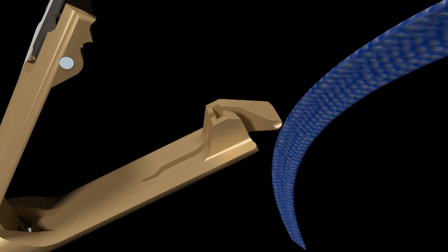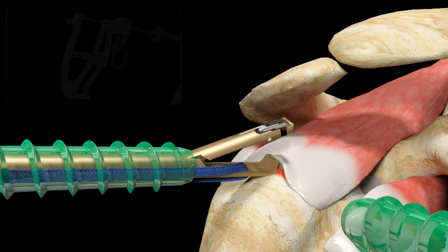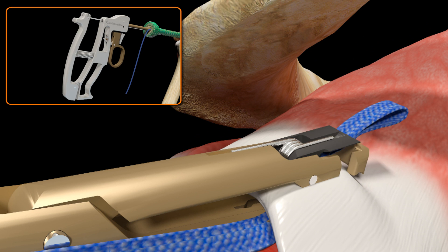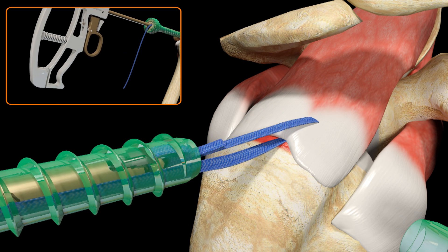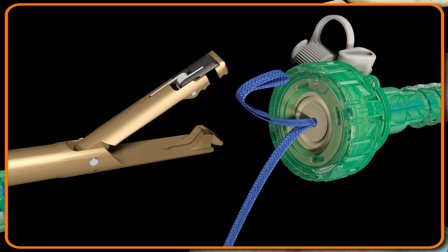Outside of the joint, load one limb of the Ultra Tape Suture into the lower jaw of the TruPass Suture Passer. Close the jaws and pass it down the lateral cannula. Position the jaws of the TruPass Suture Passer on the more anterior portion of the tendon to be repaired. Actuate the device by squeezing and releasing the rear handle to pass and retrieve the Ultra Tape Suture in one motion. The Ultra Tape Suture will remain held in the self-capture door on the upper jaw of the instrument. Close the jaws and withdraw back out of the lateral cannula. The Ultra Tape Suture is easily unloaded by pulling it out of the small window on the right-hand side of the upper jaw of the instrument.